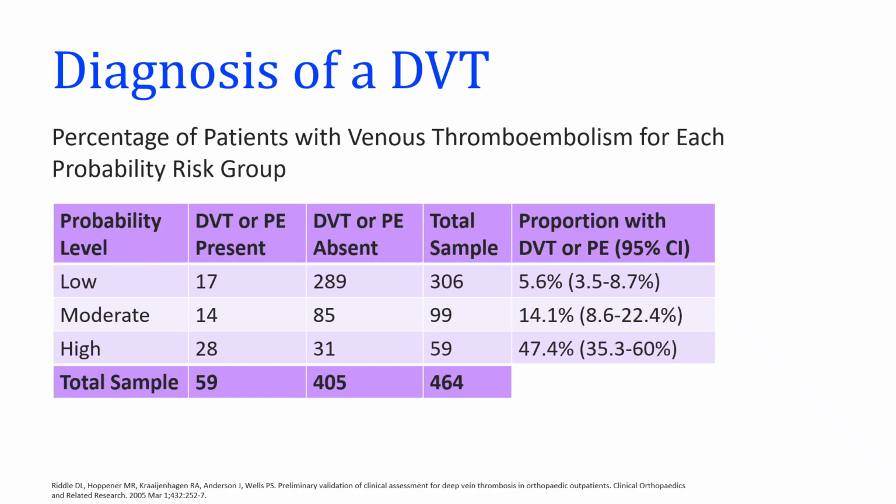While it is important that the signs and symptoms of the alternate diagnosis are adequately addressed, patients should also be instructed to report to the emergency department immediately if they experience symptoms such as syncope, shortness of breath, chest pain, palpitations, and either new or worsening leg symptoms. As previously noted, if ultrasound results are unclear or negative, but suspicion remains high for a DVT, repeat ultrasound may be performed.